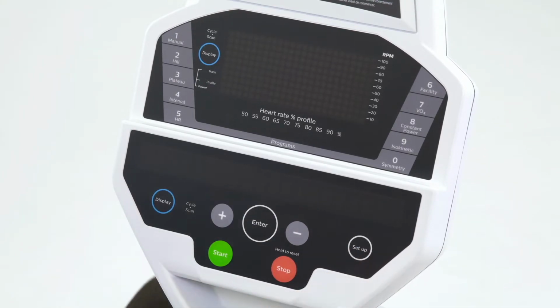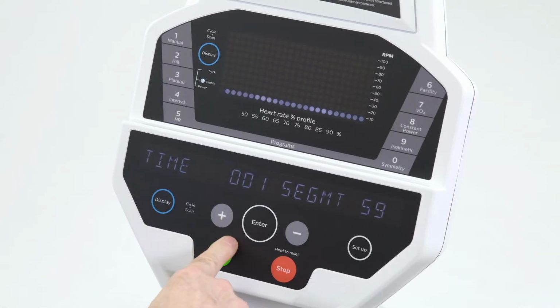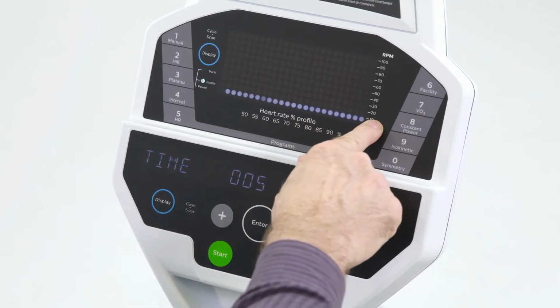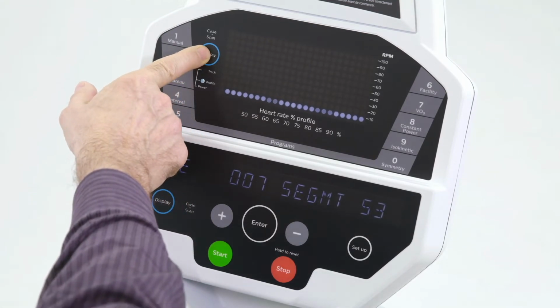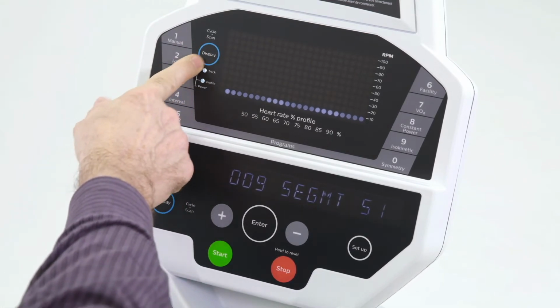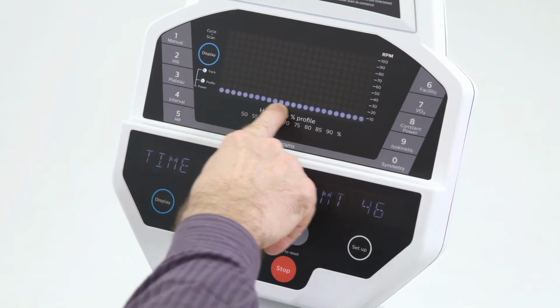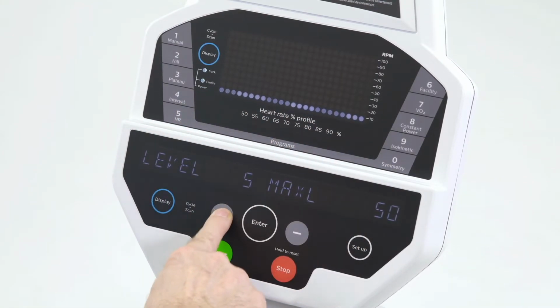In the setup, we were able to set up how many watts per row on our display, so I'm going to show how that works. So right now, the default was 10 watts per row. So right now I have one row of lights. If I come here and I press the display button, both of these light up, which indicates I am now on the power display. So this now indicates power.